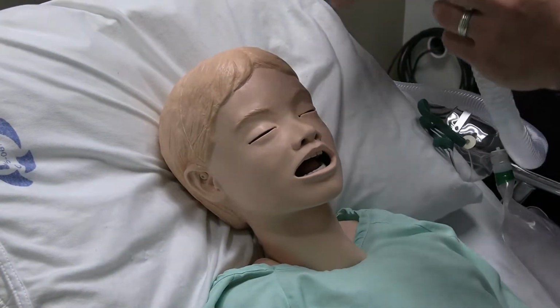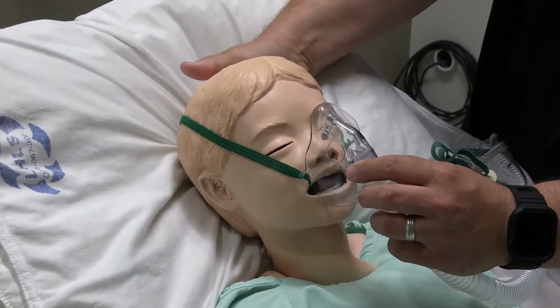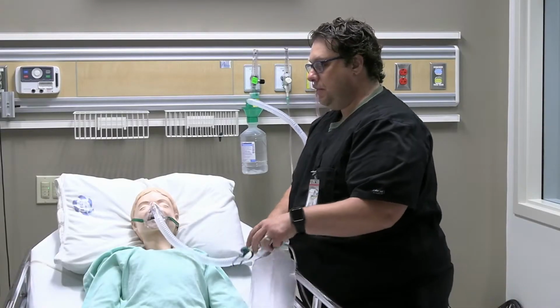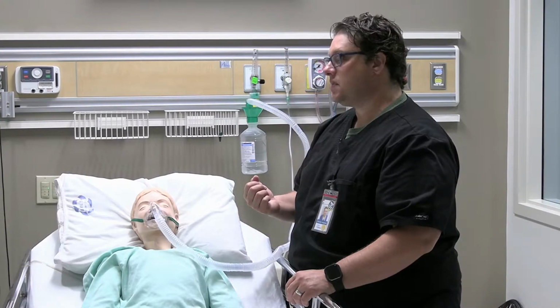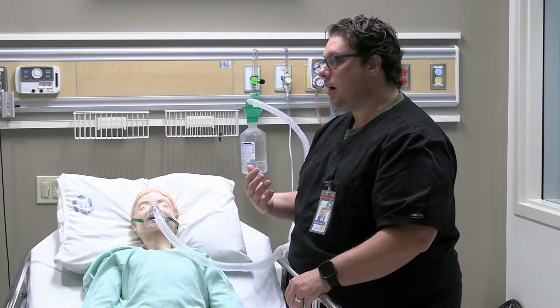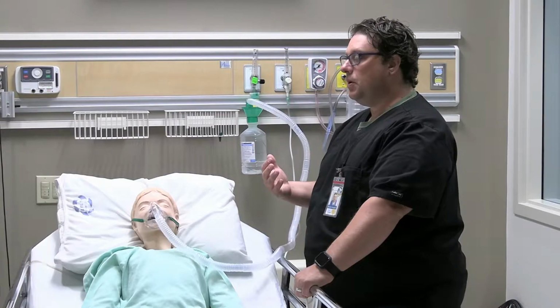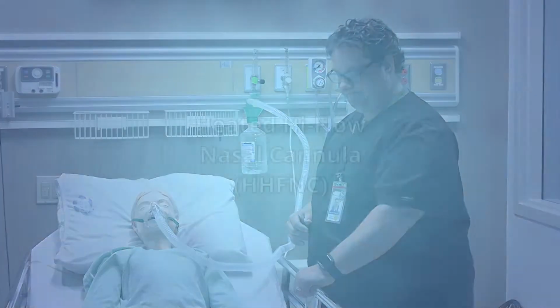and then apply the aerosol mask for the patient, just like so. Tighten the straps if you have to, just to make it comfortable for them. The other thing to keep in mind is you do want to see mist coming out of the mask as the patient breathes in and out. And that's a good indication that there is enough flow there for the patient. And then just like the previous patient, on the higher FiO2 and the vitals are stable, consider weaning based off your oxygen sat targets.